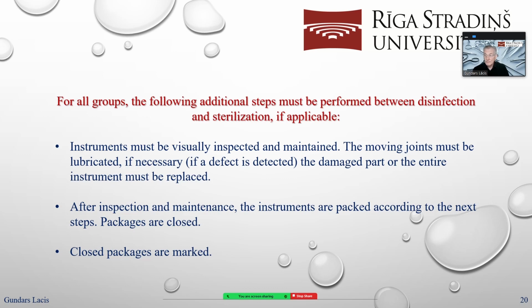After inspection and maintenance, the instruments are packed according to the next steps. It can be a little bit different, it depends on what we are doing next. Packing depends on the next step, and packages are always closed.